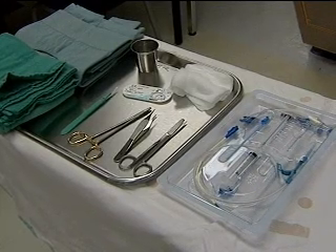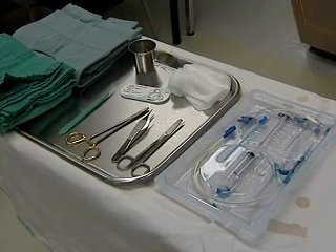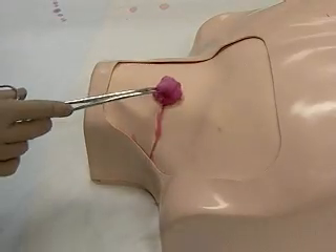To demonstrate the landmark-based technique for central venous line placement, we're using the equipment in this central line kit and suture tray, and our patient is a simulation mannequin.